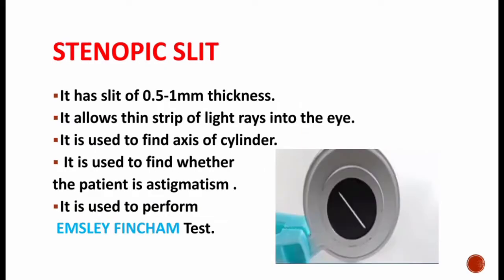Next, stenopic slit. The image displayed in this slide is the image of the stenopic slit. It has a slit of 0.5 to 1 mm thickness. The length of the slit is usually around 20 mm.